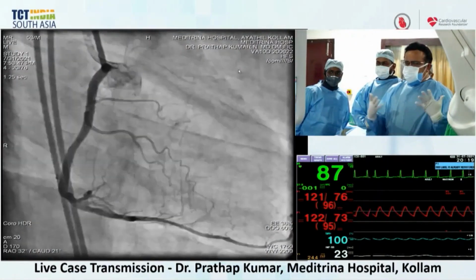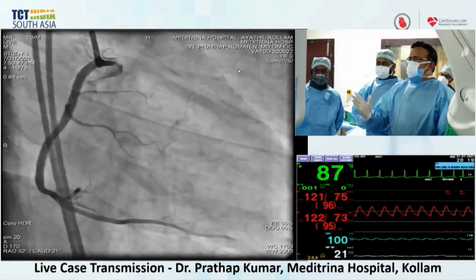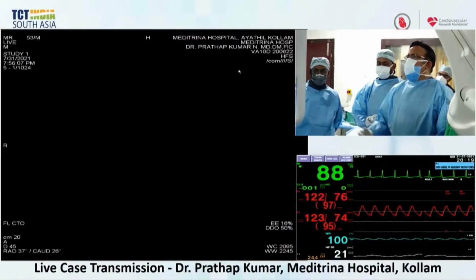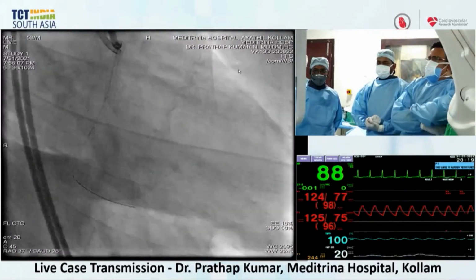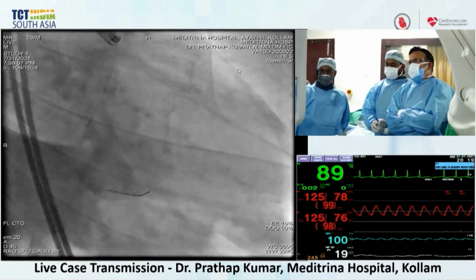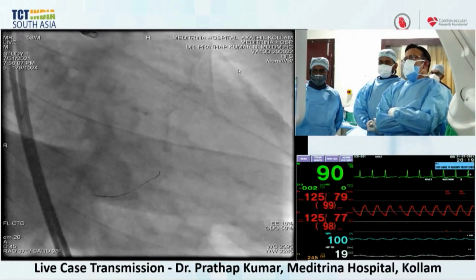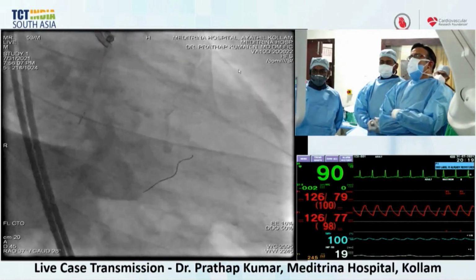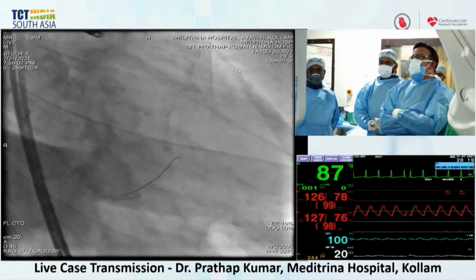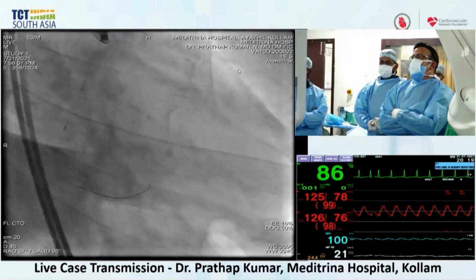Sanjog, actually it can create problems also, but at the same time it is an excellent connection. Almost all the connections are collateral CC3 or CC2 minimum. So we just took a wire. Actually, I took a Caravel with a Fielder FC wire. Probably the approach will be different. That was not the vessel I was looking for. That's not the connection I was looking for.